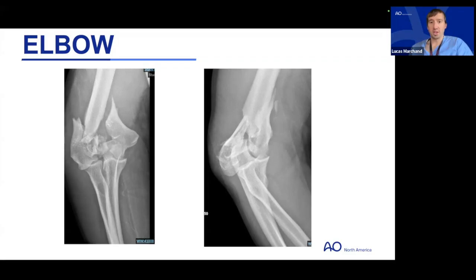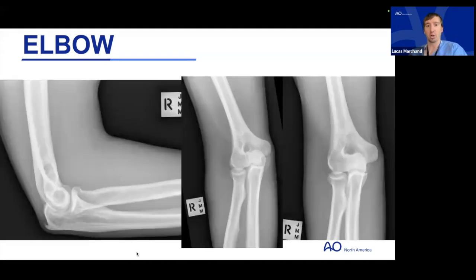Yeah, I was kind of hoping you would say that because I do find those 3D reformats, or what you'll sometimes hear people call surface rendered images, super helpful for complex intra-articular fractures like this, especially in the elbow, because getting the reconstruction of a perfect coronal, sagittal, or axial cut is very challenging. But as we continue to talk about plain film radiographs, we had mentioned earlier, there are typically three views of the elbow. We get AP, lateral, and oblique views. This is what they look like.